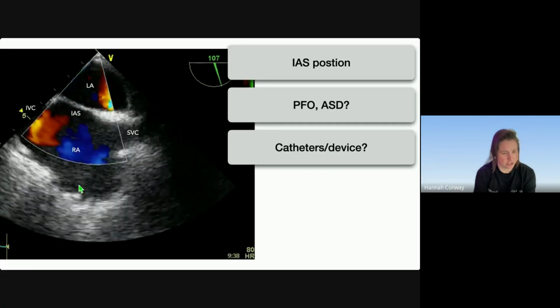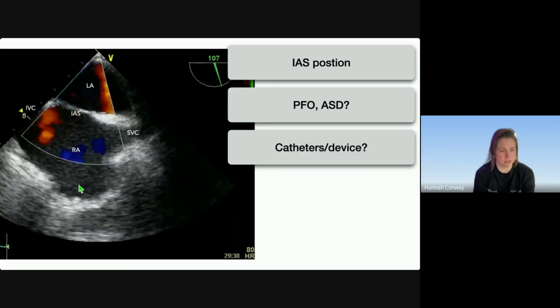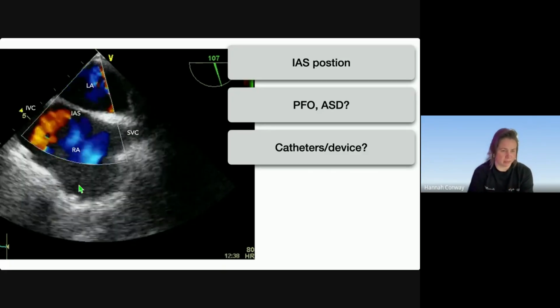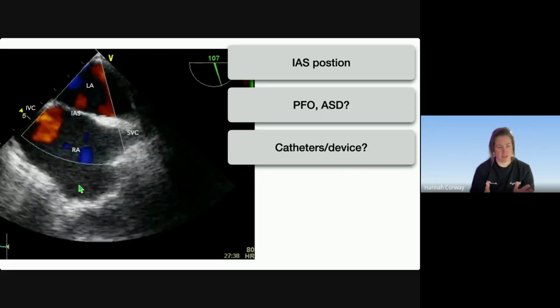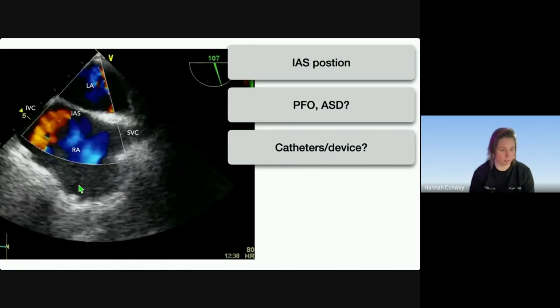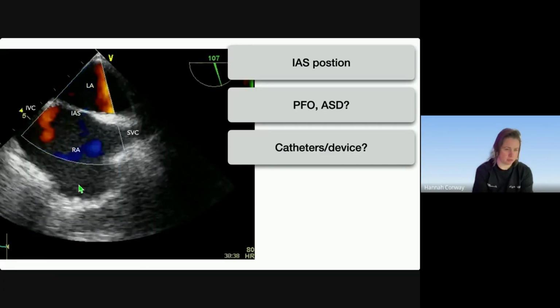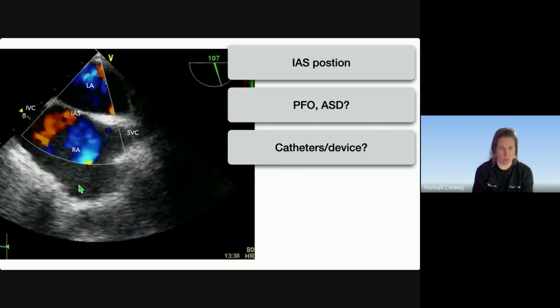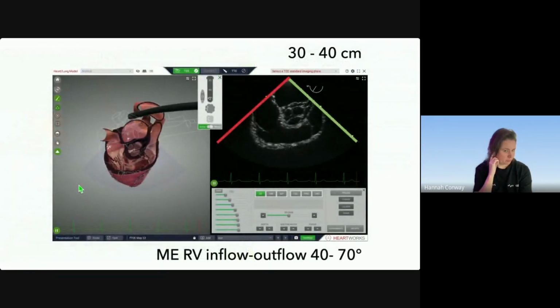And in addition to ECMO cannulas, there are other things that we know sit in the right atrium, and one of those will be PA catheters. If you're worried about going around in circles with your PA catheter, certainly I think TOE or transthoracic guidance can help determine where you are in the heart. And obviously you can also determine where your wire is just before you dilate, for example. So these are all useful things to think about when you're performing TOE.